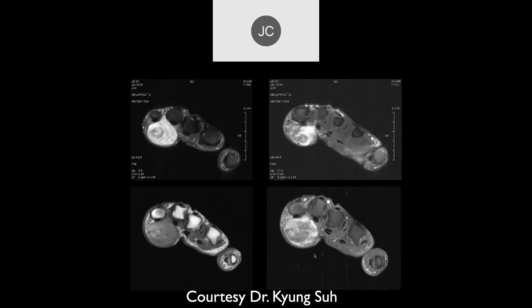We're talking about vascular lesions. I'm not quite sure. It's relatively sharply defined on some images, but not on others. It's very inhomogeneous. Assuming this is post-contrast, there are focal areas that may enhance, but other areas that don't. So obviously this is not a clearly benign lesion, and therefore you'd have to go with further evaluation. And this ended up being an angioleiomyoma.